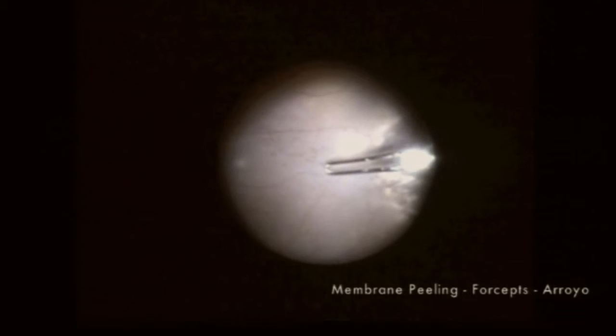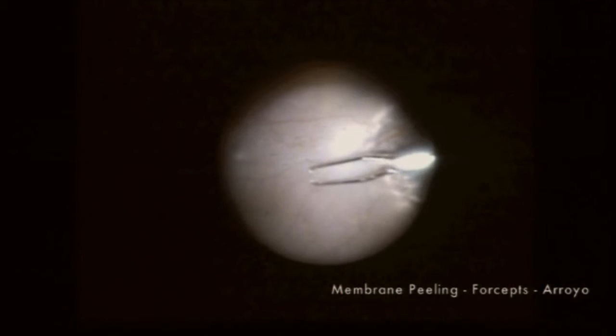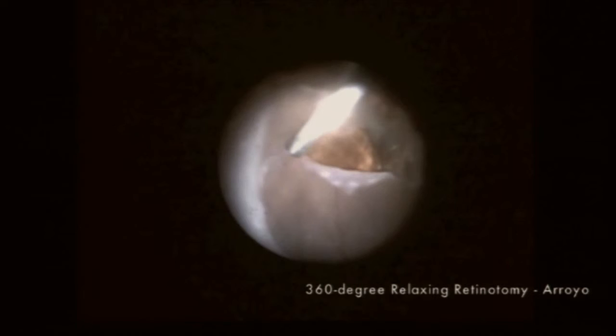We performed membrane peeling with a retinal pick as well as with ILM forceps. Due to the extent of traction, a relaxing retinotomy was created by first endodiathermy-izing retinal vessels, as Dean just pointed out, and using the vitreous cutter to create the relaxing retinotomy.